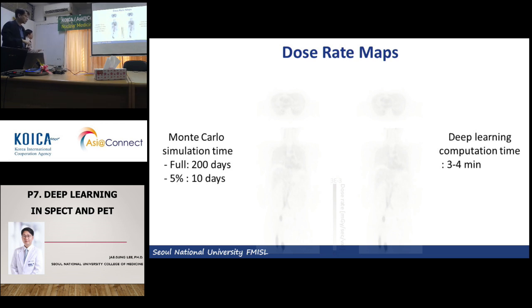Here we have a human, and we inject radioisotopes, and then it's distributed all over the body, here and brain. And then we are interested in some critical organ. It's receiving radiation from adjacent or remote organs. That's the basic principle.